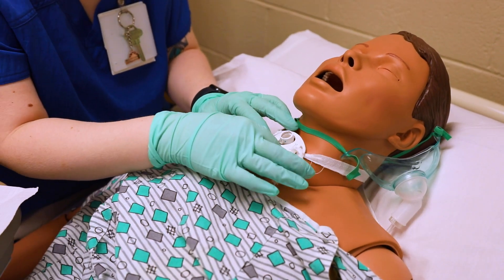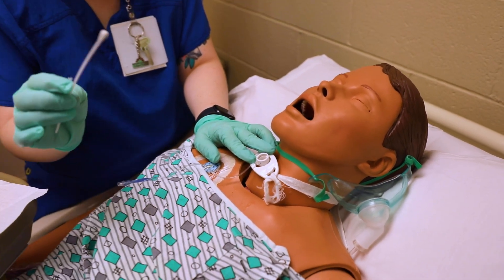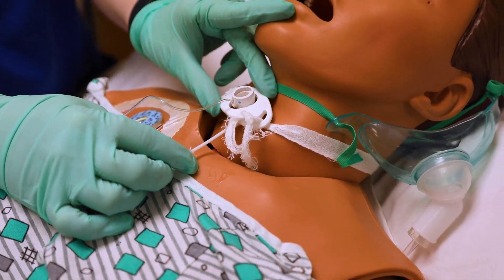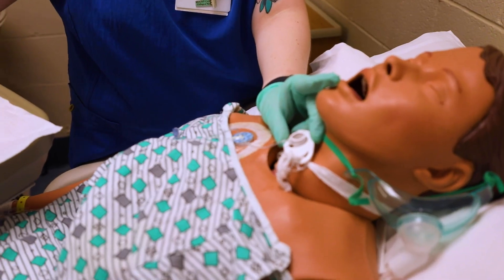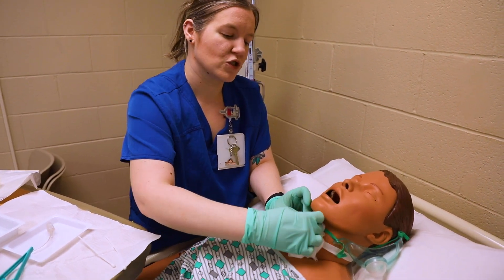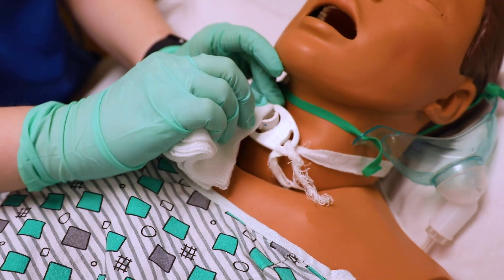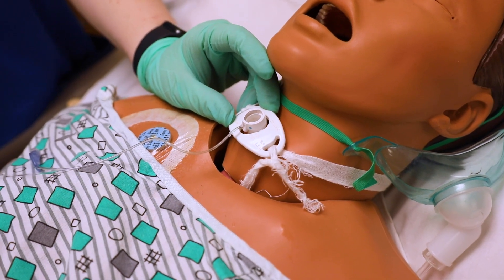Now you need to clean under the trach. If the person already had a dressing, remove it at this point. Take your cotton swabs dipped in saline and clean right around the tubing. I'll lift this up so you can kind of see — I'm cleaning right around that tubing. Hold your trach plate, clean all around it. You may have to use your four-by-fours to dry; if the patient has a lot of mucus, use a Yankauer suction. Clean as much under that trach plate as possible, since that's where it sits on the skin.